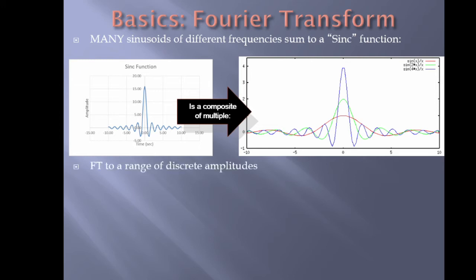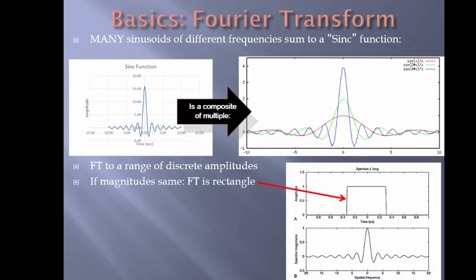Well, the Fourier transform, when you have more than three of these things, instead of just a collection of spikes, you start getting basically a rectangle, because you have a continuous range of frequencies, okay? This is how an RF pulse is generated.